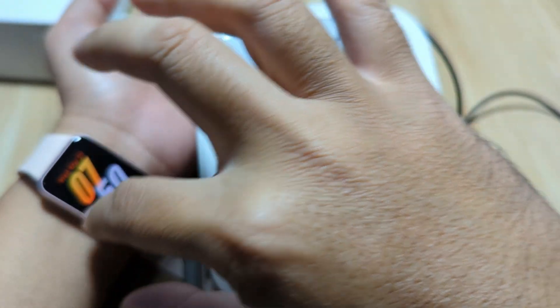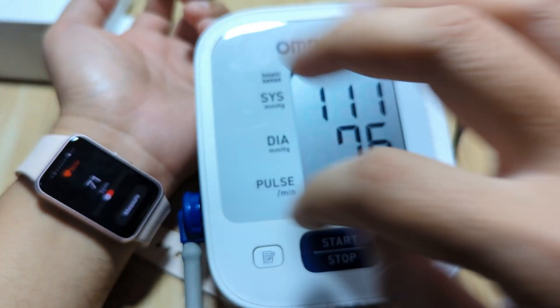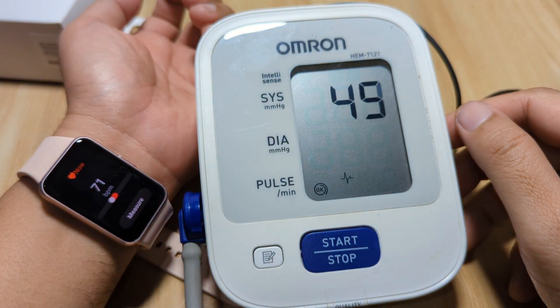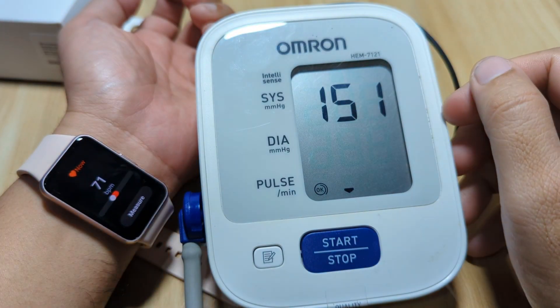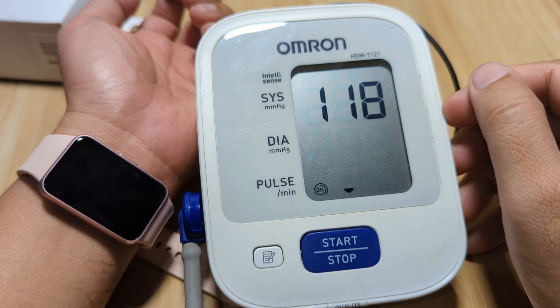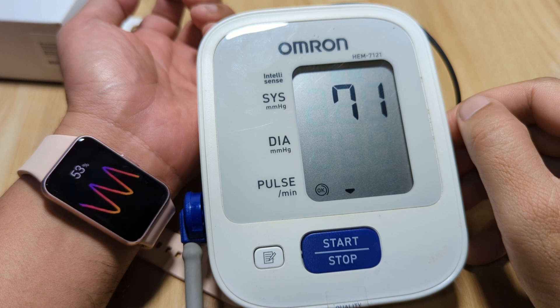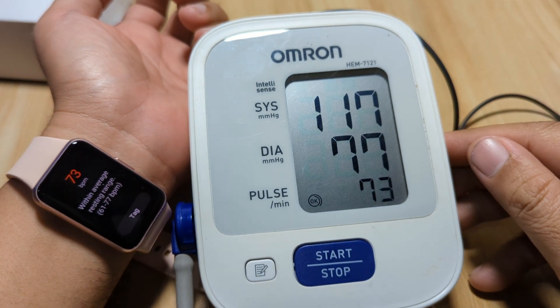And last one — let's have another measurement just to make sure. We have 73 on the Galaxy Fit 3, and as you can see here we have the same results here. Very good so far.